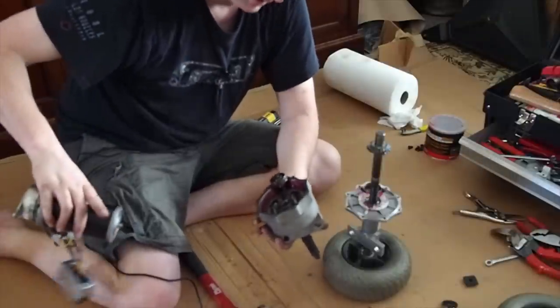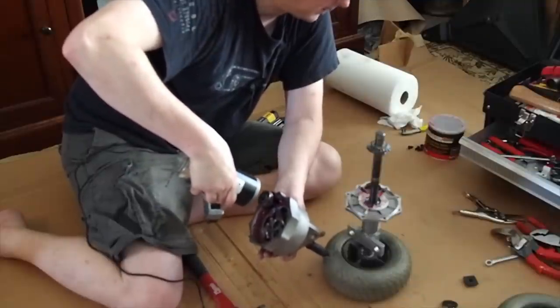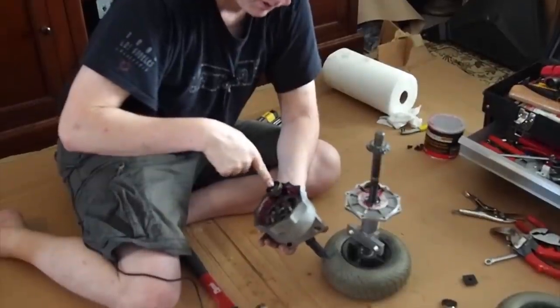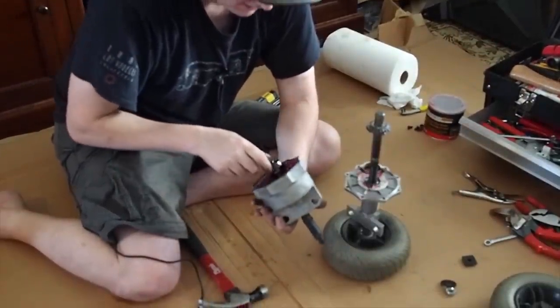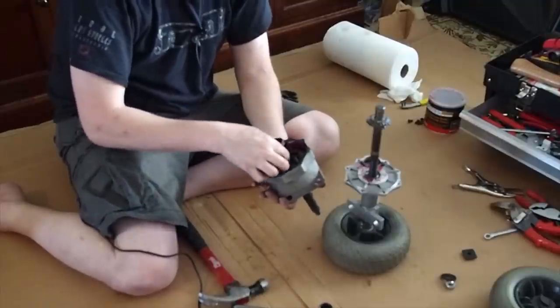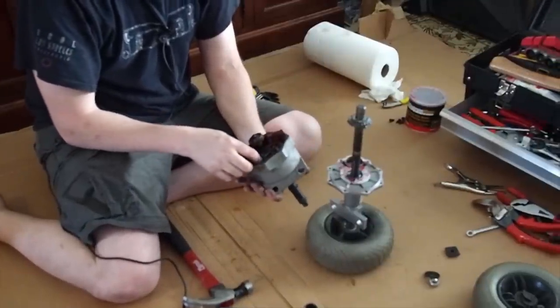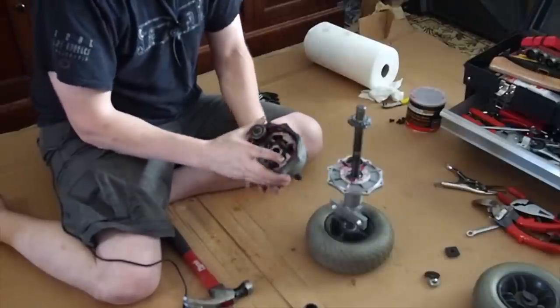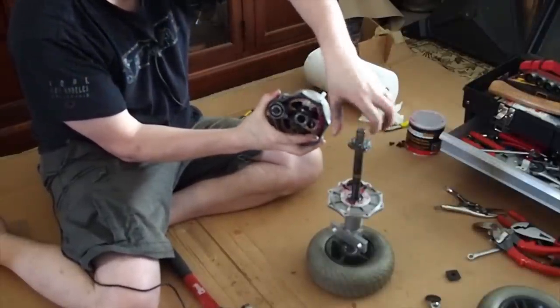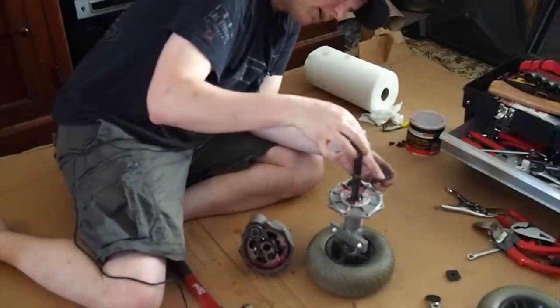Good. This sits right inside there, or actually not right inside there because there's another piece, but this sits right there for the motor. So this motor is attached here, and this just keeps this from spinning out. There are two things that I wanted to do. There are some bearings in this assembly that I want to make sure are okay. You can see that if I turn this, those turn those ways, these turn in that direction, and they would turn this shaft there.